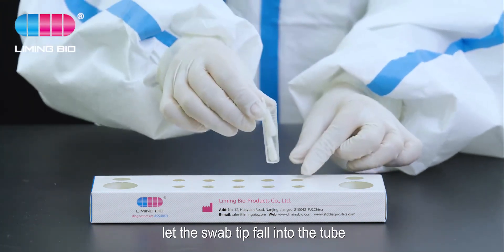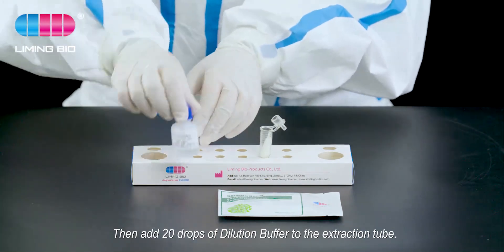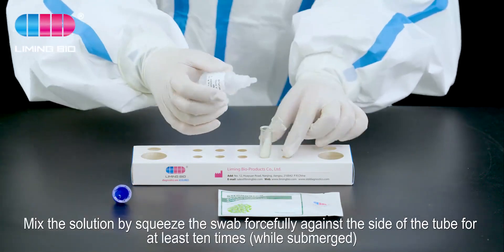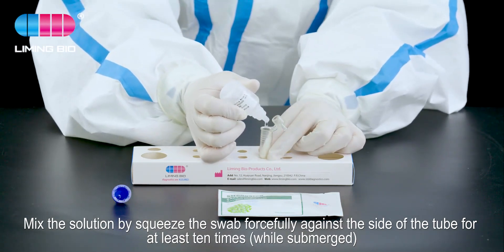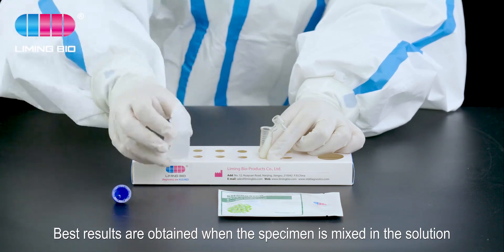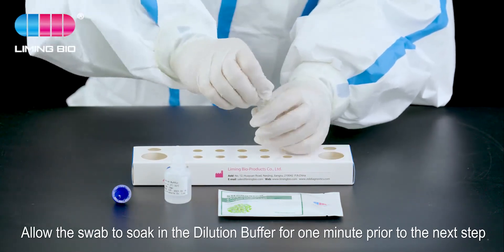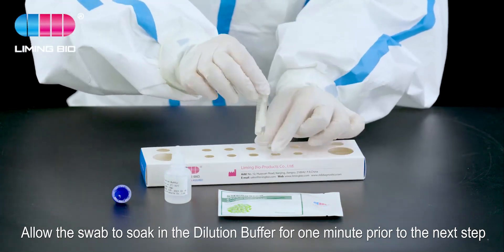Let the swab tip fall into the tube. Then add 20 drops of dilution buffer to the extraction tube. Mix the solution by squeezing the swab forcefully against the side of the tube for at least 10 times while submerged. The best results are obtained when the specimen is thoroughly mixed in the solution.